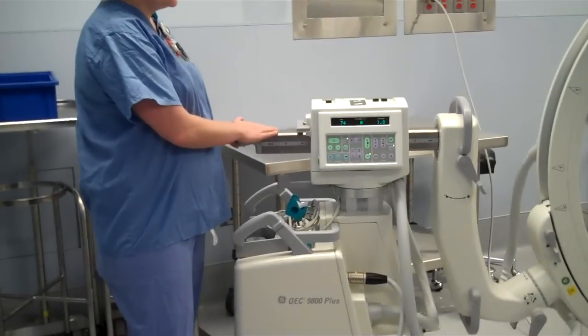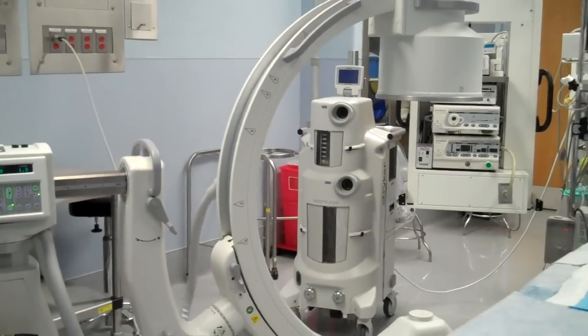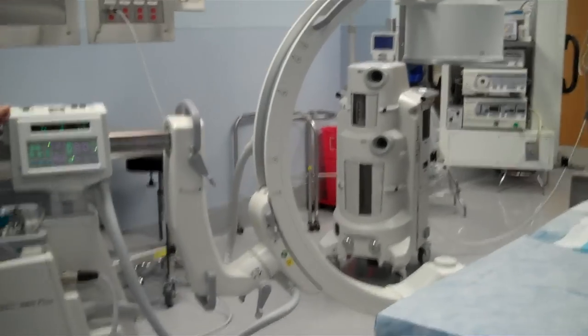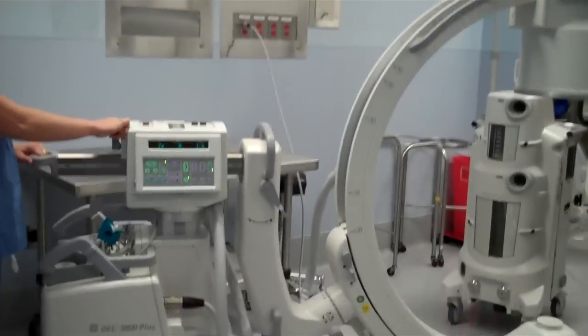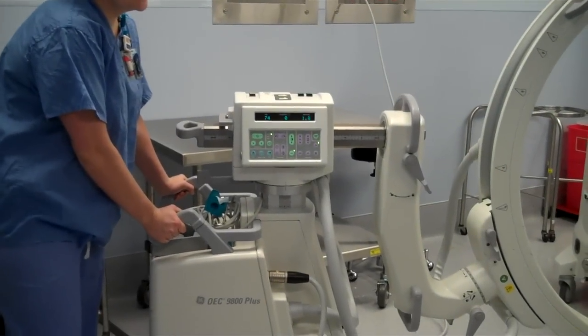This lock right here is the in-out lock. It allows you to move closer and further. It gives you about a 10 to 12 inch range. This is a nice lock because you can get closer or center on the anatomy that you want without moving the entire heavy base, because it's very hard to move.